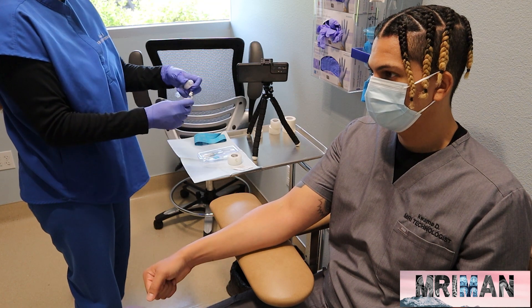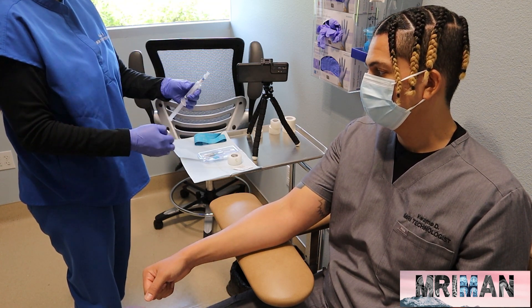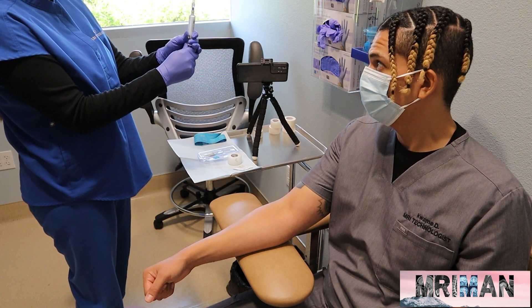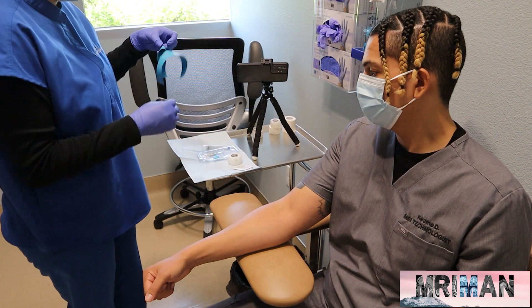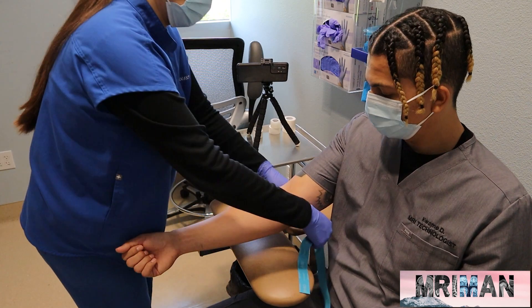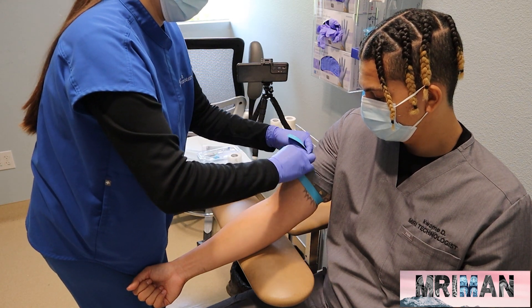So what I'm going to do now, I'm going to connect the saline flush to the adapter that's going to connect to the IV catheter later on. And now I'm going to tie the tourniquet around the arm. I usually do it about two inches above where I'm going to go in to a vein.